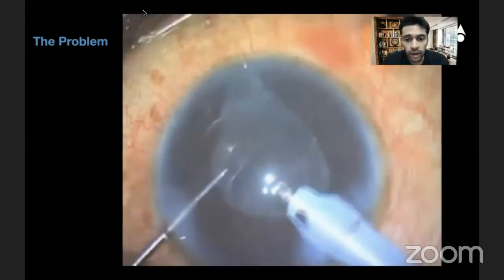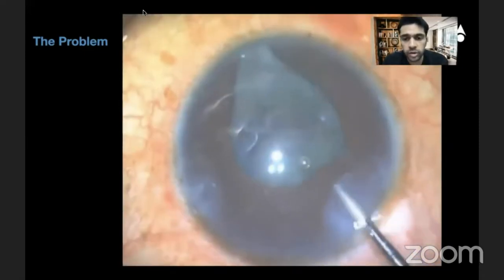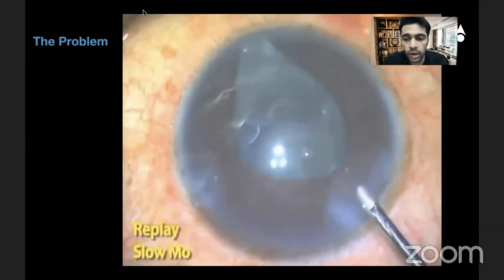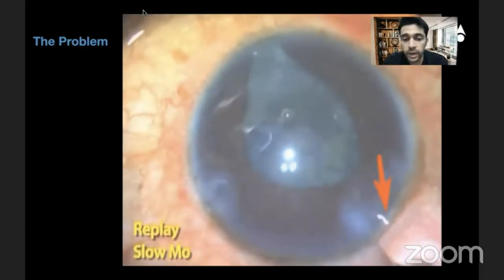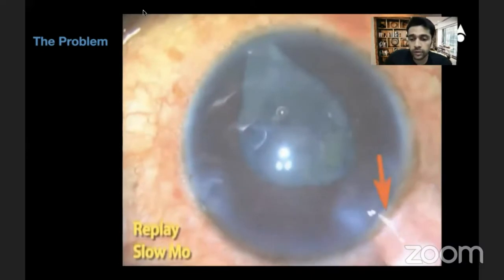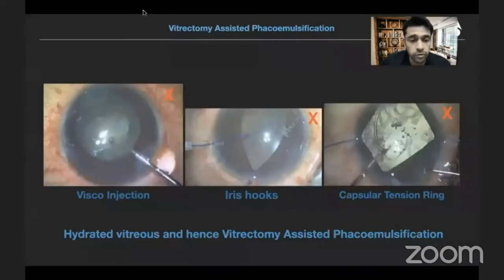In these scenarios you have to wonder: at the end of FACO emulsification, look — the viscoelastic I'm pushing in is not going into the eye; rather it is blobbing outside. This is a very clear sign that the issue is posterior segment based, not capsule or iris hook based. A lot of surgeons see this and start pushing in more viscoelastic, causing more tension, or they push in iris hooks or capsule tension rings — all three of which will not help, because the problem is posterior segment swelling of the vitreous body.